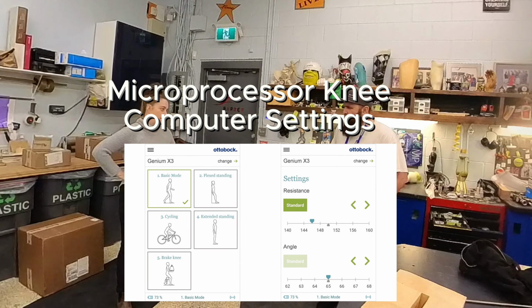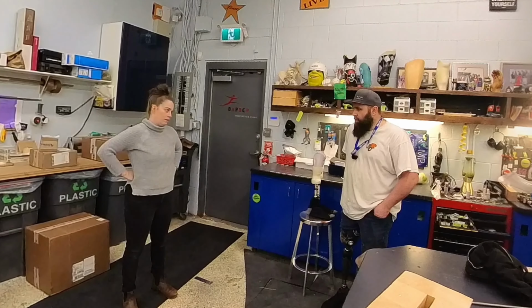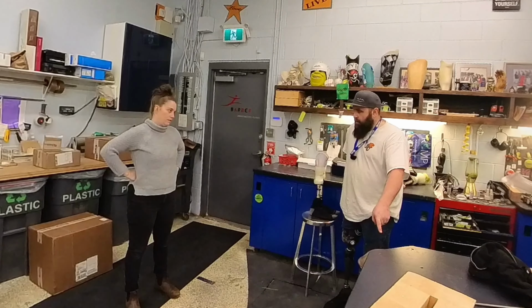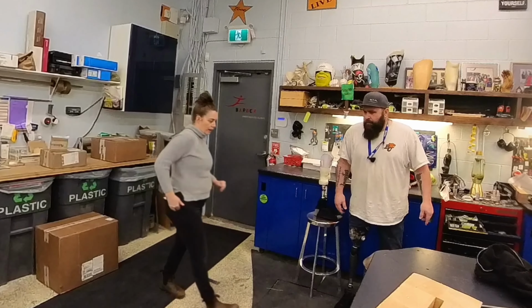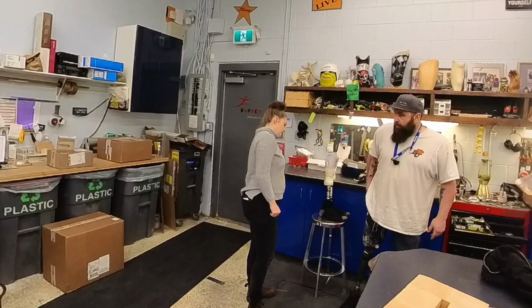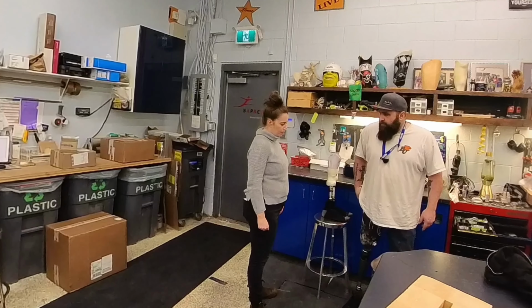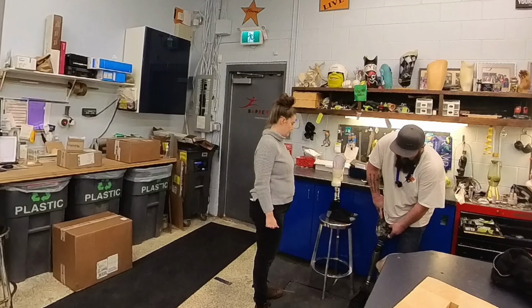Why is this fitting weird? Like my skin is actually touching the socket. That my liner's touching the socket. Not that it matters, I don't care. Where? On the inside or the outside? Right here. Oh yeah, like it's touching. Do you need to re-put your liner on? I'll try it, but I just pulled it off.